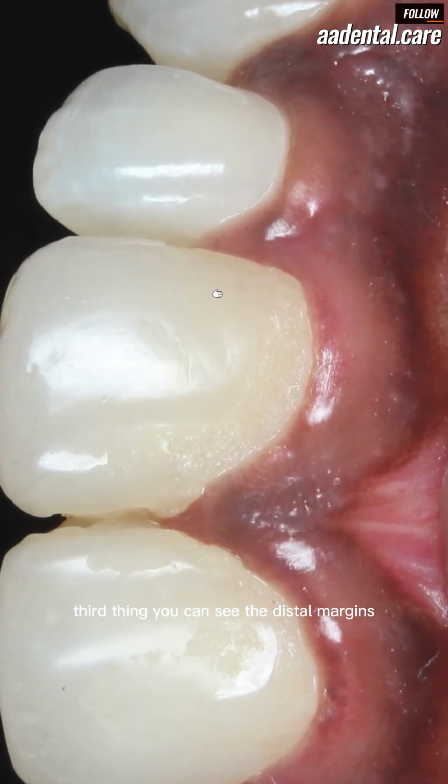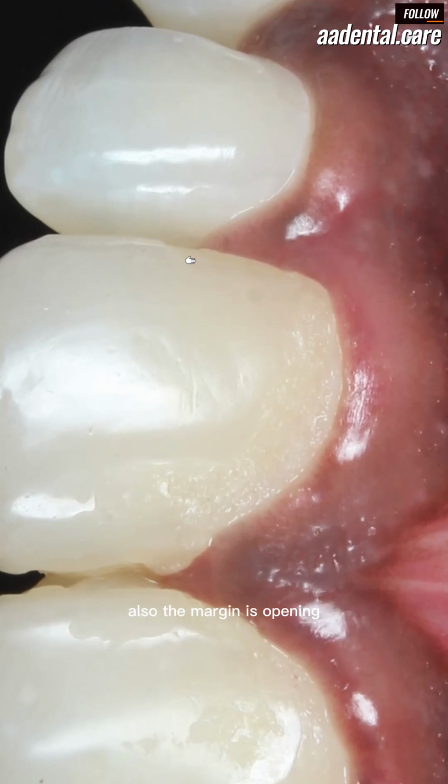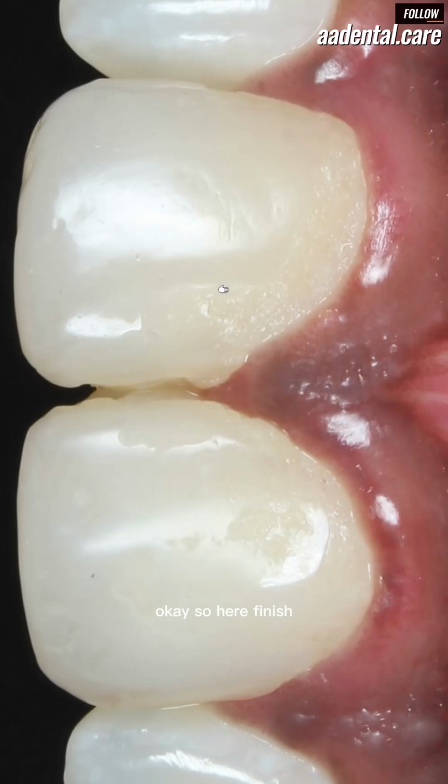Third thing, you can see the distal margins also, they are not well adapted. The margin is very rough and somewhere it is fractured also, the margin is opening. And the next stage after this will be the cervical caries, because all of the composite which was present here is already gone. You can see the difference between the finishing and polishing of this portion and this portion. The finishing and polishing was done properly here, but in this region it was not done properly. These are 2-3 reasons which can cause a condition like this.